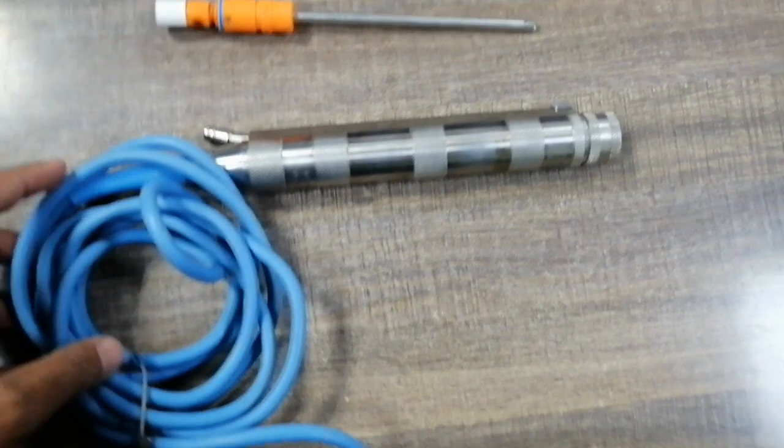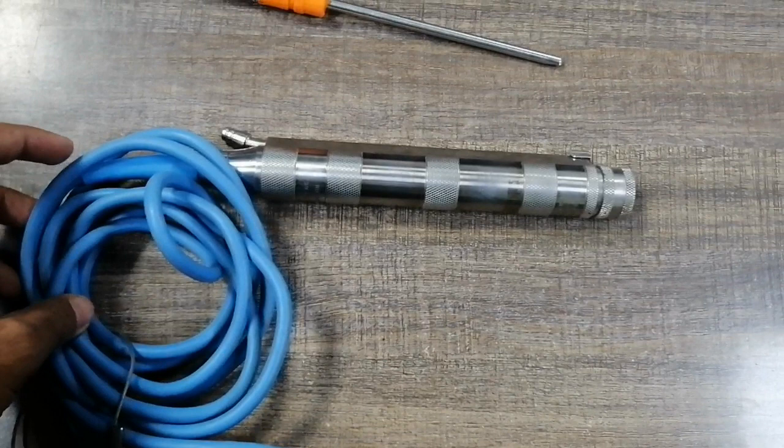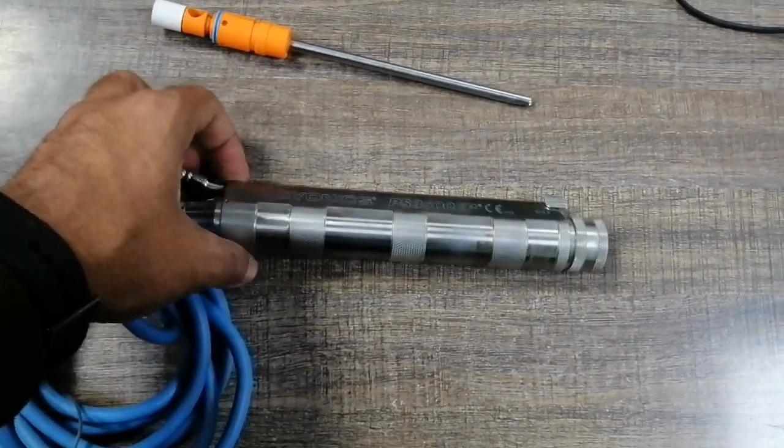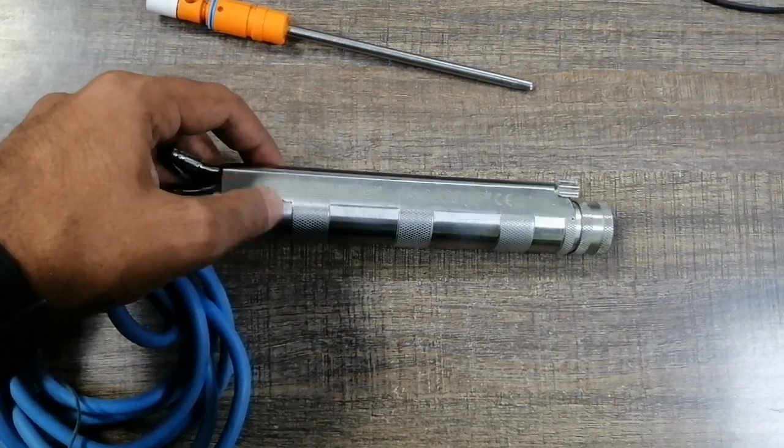This is the handpiece. There are approximately seven state-of-the-art blade designs — straight, curved, rotating, and many more. Multiple handpieces are also available for arthroscopy procedures.